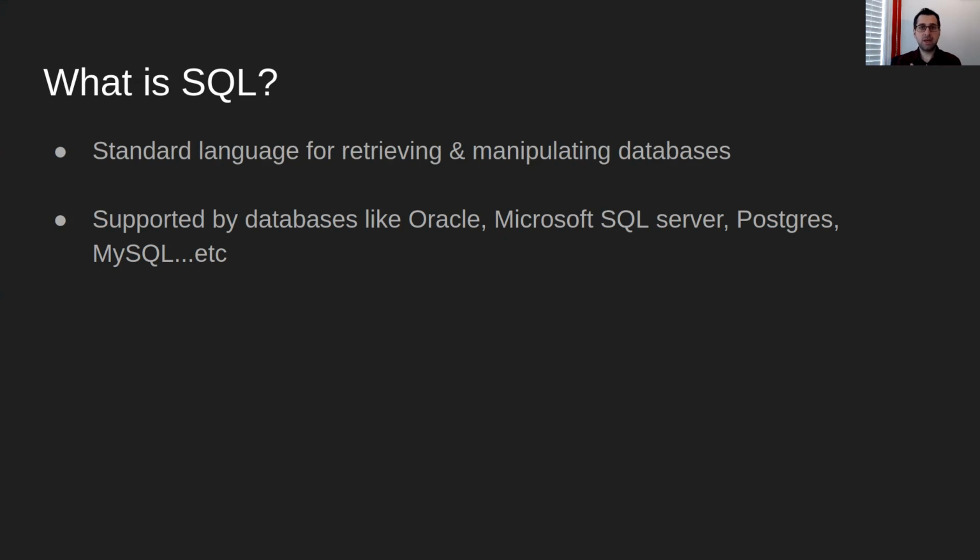Just like for medical imaging, we have standards like DICOM and HL7. For databases, there's a standard called SQL, and it is the standard for being able to read the data from the database as well as write to that data from the database. However, just like DICOM and HL7, the standard is not 100% strong. So there are some slight variations, and we'll talk about that in more detail later.